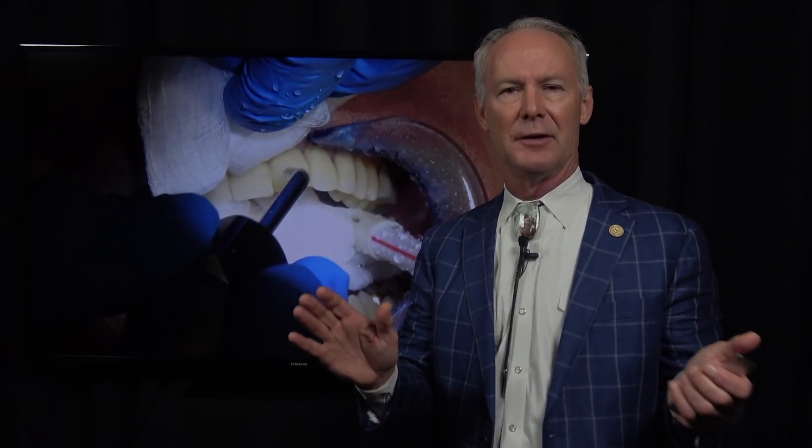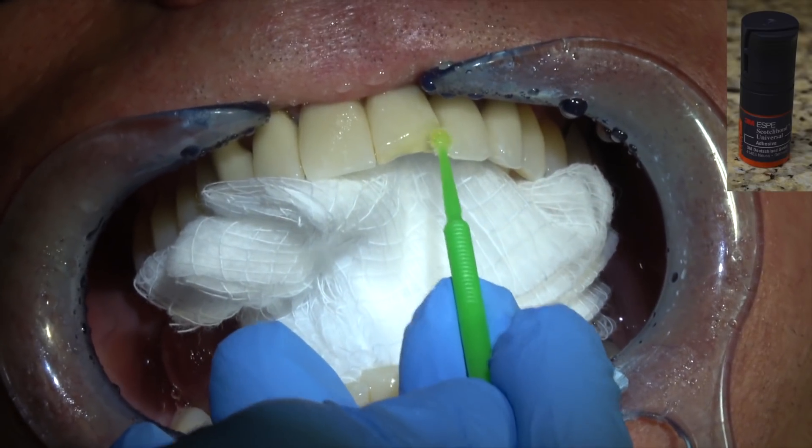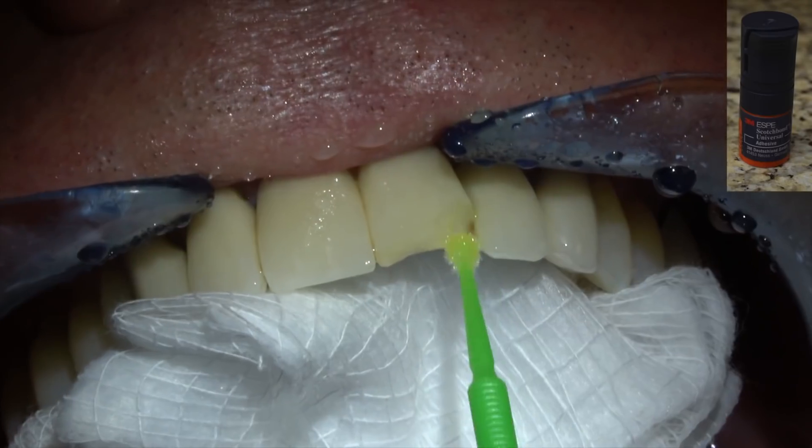You'll notice I'm not using silane. Some of you will disagree with that. I've not used silane in about 35 years. The reason I don't use silane is because the studies show — and this is what I've found — that the mechanical retention of porcelain is plenty strong enough without silane. And if silane is not used correctly, it can be a contaminant. So I'm only teaching you techniques that work, and I want to make them simple and predictable.